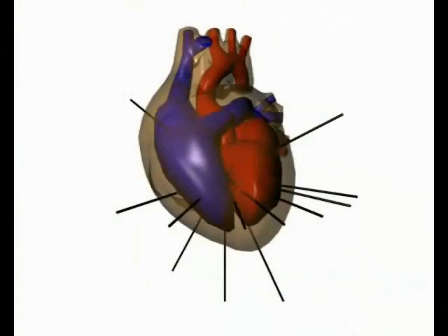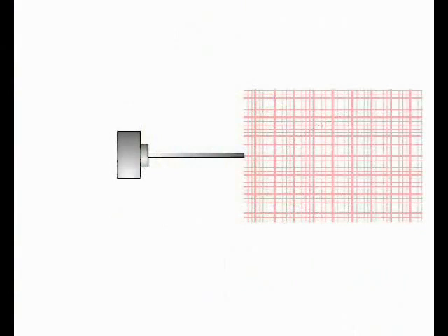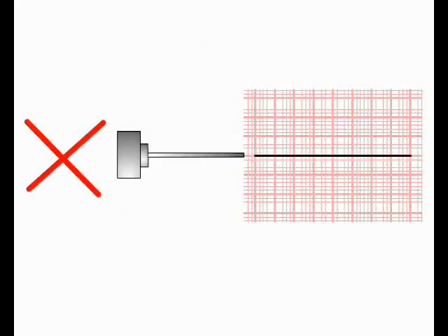We'll see how this works later, but for now we need to understand how the individual ECG leads analyse and record cardiac current. In any ECG lead, the flat line recorded on the readout when no net current is flowing is termed the isoelectric line.